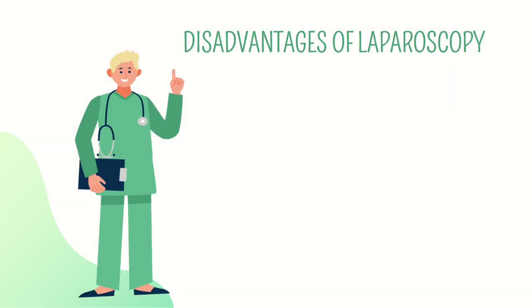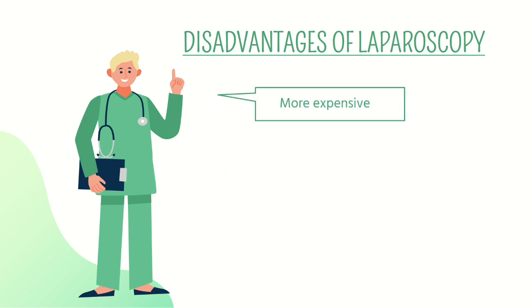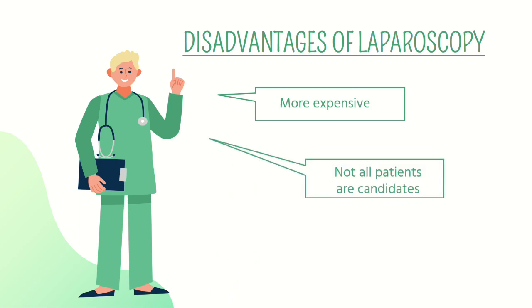However, the disadvantages of laparoscopy are, because of the specialized equipment that will be used, the surgery is more expensive. Another disadvantage is that not all patients are candidates for laparoscopic surgery. You need to have a cardiopulmonary clearance first before the surgery, because only general anesthesia can be used when doing a laparoscopy.